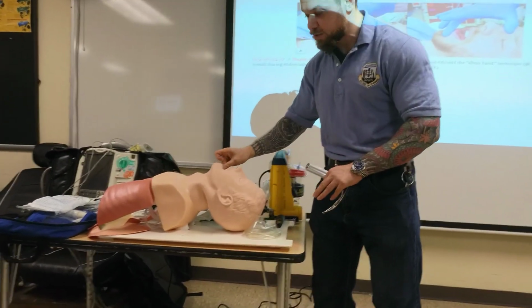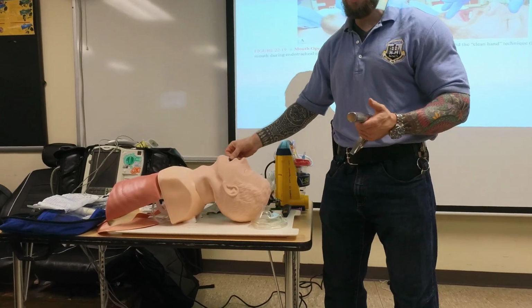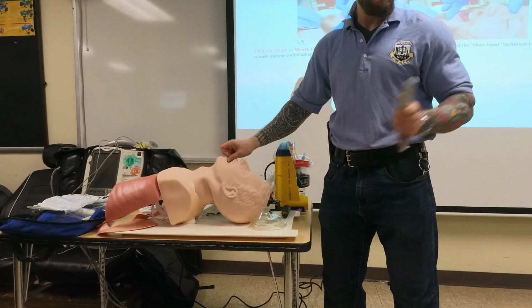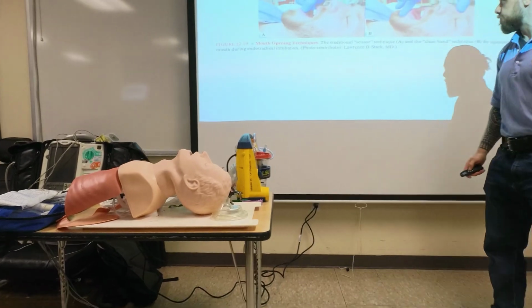You start doing this. If you push your drugs and you know they're not going to chomp down, maybe guys in cardiac arrest, I'll say fine. But the moment they chomp down on your arms, you're not going to be too happy. I think Bob had that happen to him.